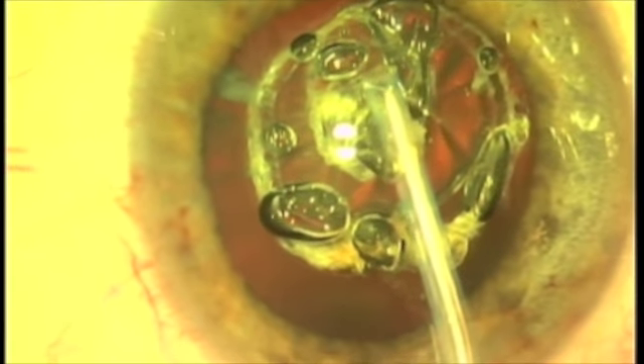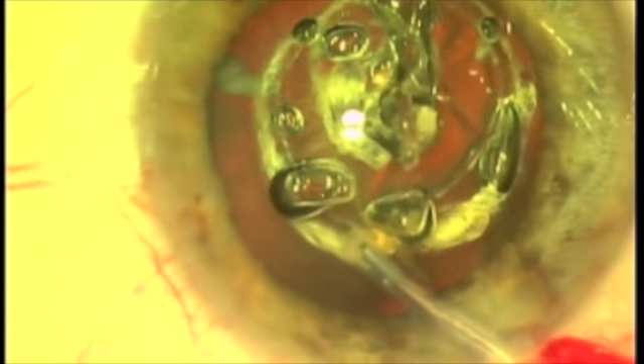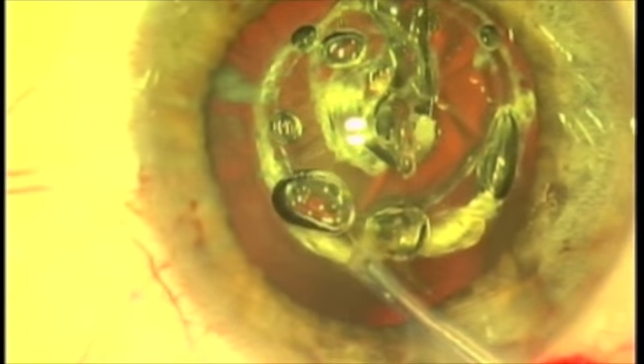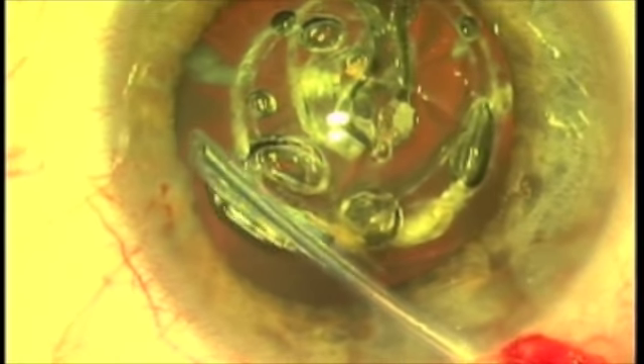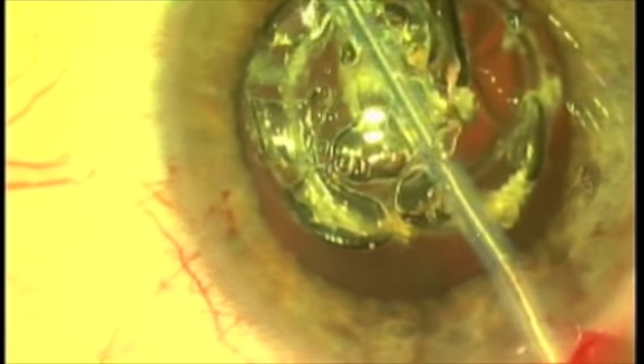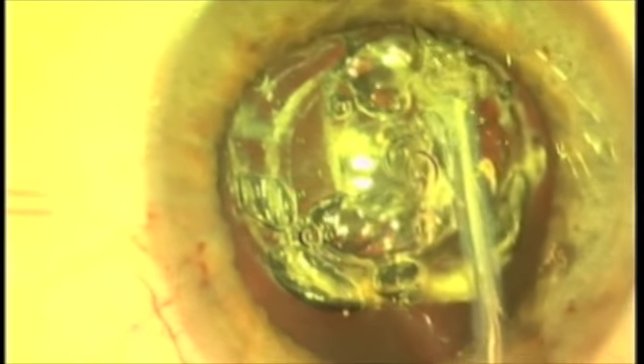It causes the molecular lattice to fracture. You see those little opacities there — those are fragmented little fractions or fragments of lens material. They're not coagulation.